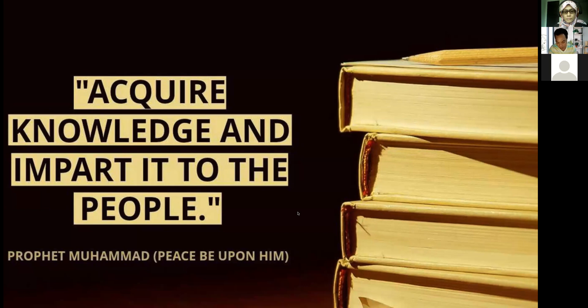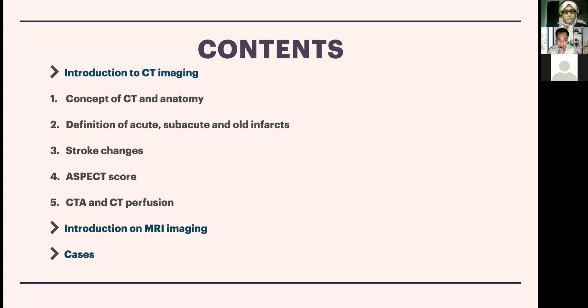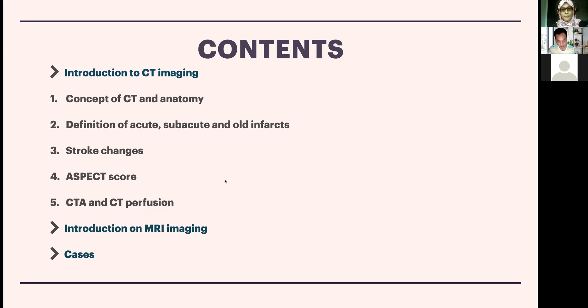The outline today covers the most commonly available imaging — CT concepts, CT anatomy, and then different timing of strokes: acute, subacute, and old infarcts. We'll also cover the ASPECTS score, CTA, CT perfusion, and MRI imaging. I'll briefly go through CTA and CT perfusion even though not all centers have these, and then show some local cases from HKL.